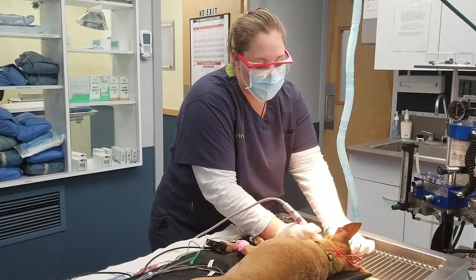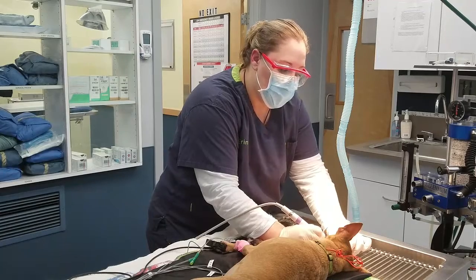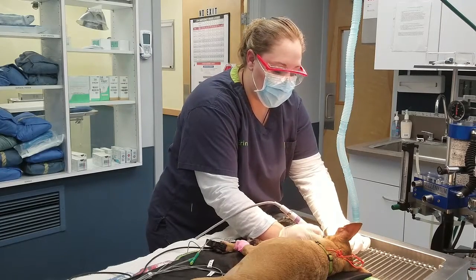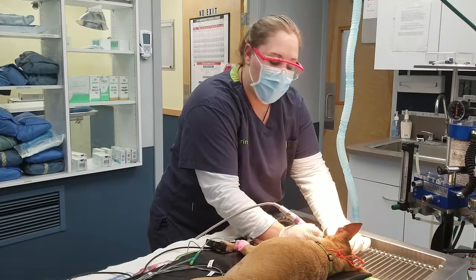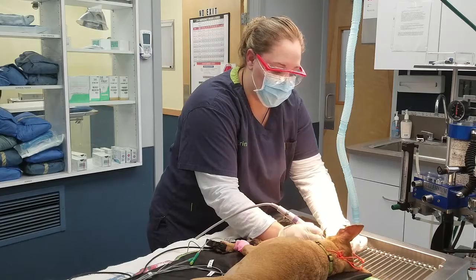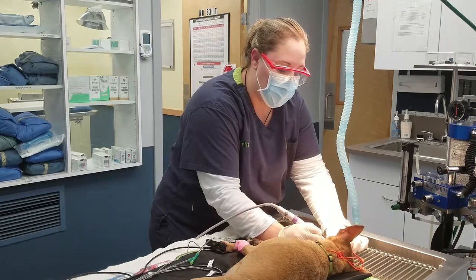We don't want to spend too long on each tooth because it can overheat. You want to make sure that you have an appropriate amount of water flowing from your handpiece as well. If you don't, then that can also cause it to overheat and cause damage to the tooth, because the tooth is a living part of the body.